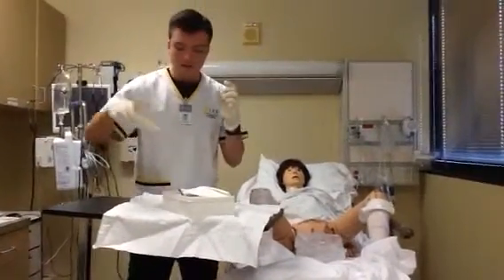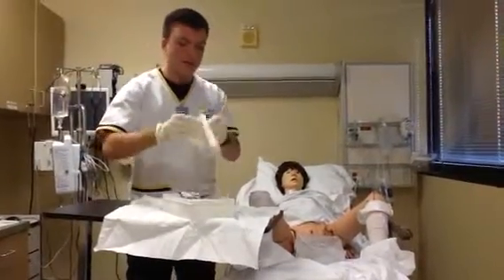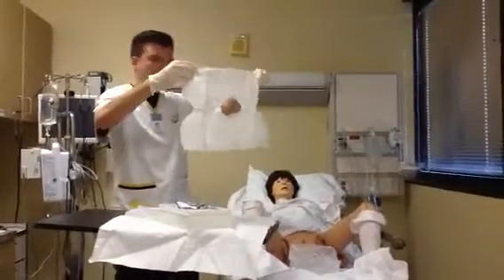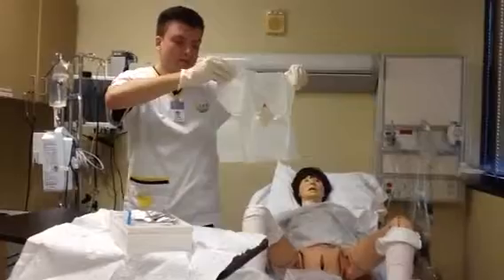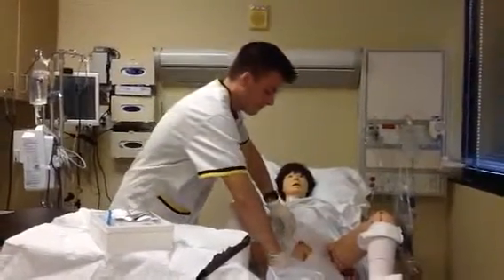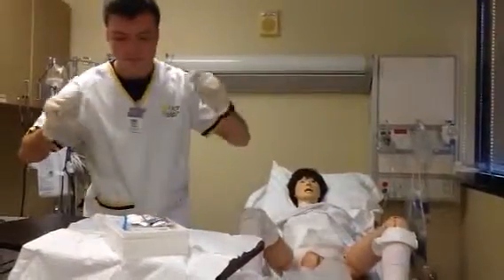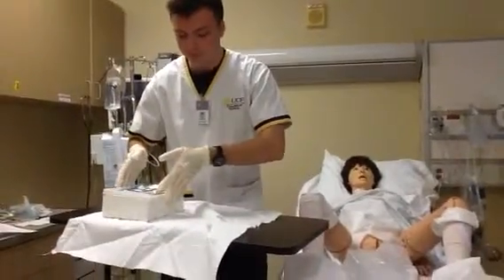So I will take my gloves that I do not need, and I will take my drape here. And since I am sterile, I can touch this drape anywhere that I want. Making sure at all times that I am facing my sterile field, I'm going to drape this drape over Mrs. Knight. Okay, and once it is draped, I cannot touch it. At this point, I'm going to make some adjustments here.